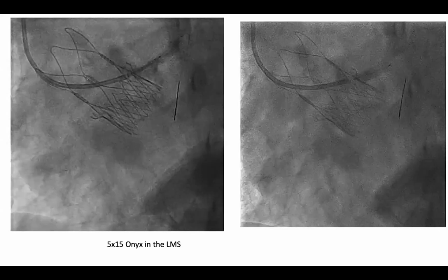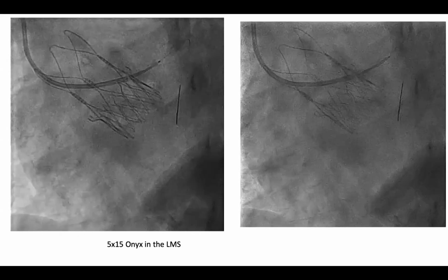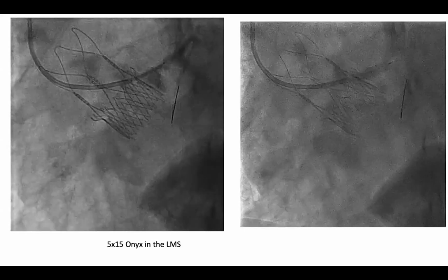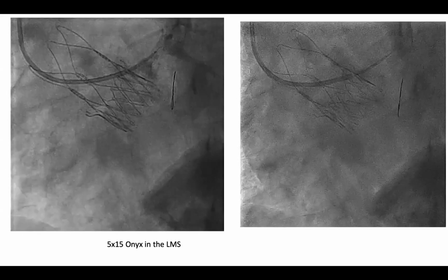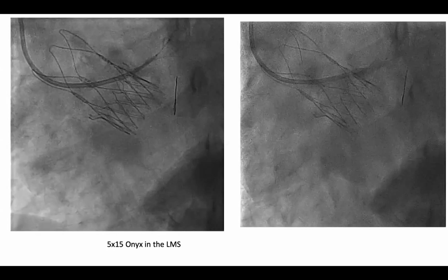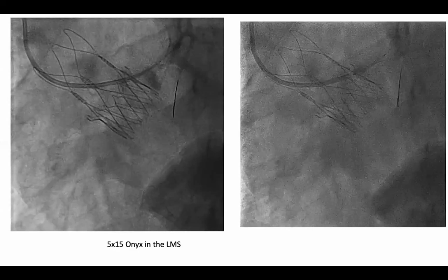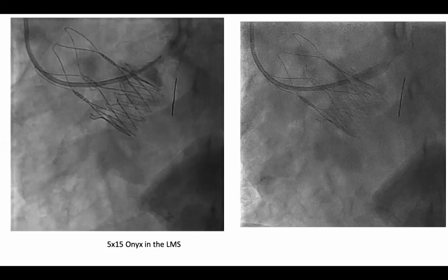So the option wasn't to actually get the calcific nodule or calcification or the stenosis all the way into the wall, but to just push it enough so that we have an MLA of a slightly higher size than what it was. No, my question is that there won't be any stent available on the coronary lab shelf that will be big enough for you to cover this if you are thinking 8 to 9.